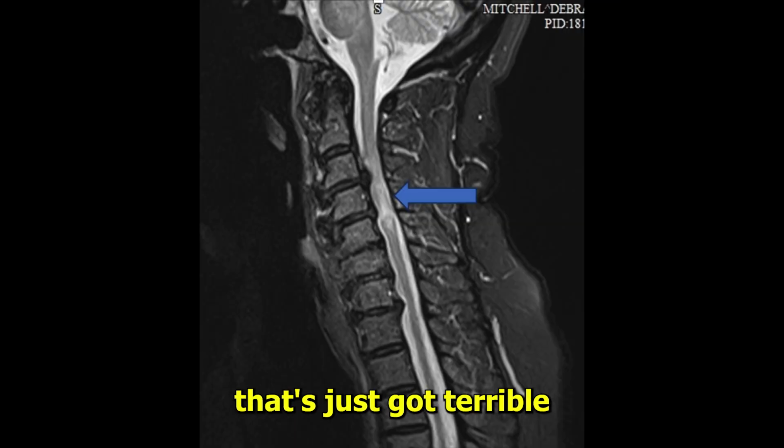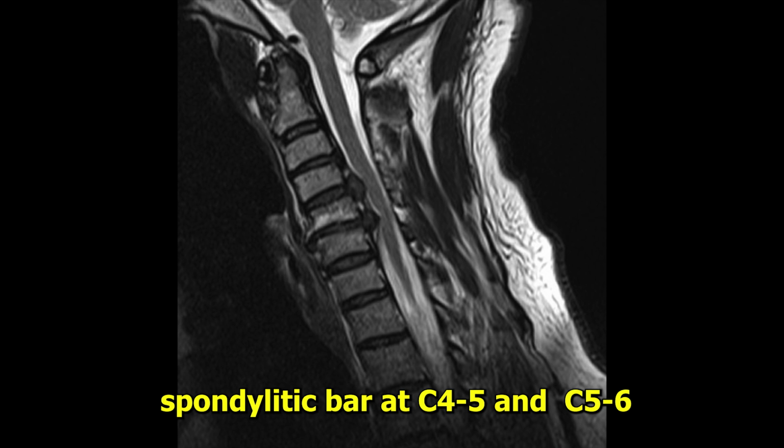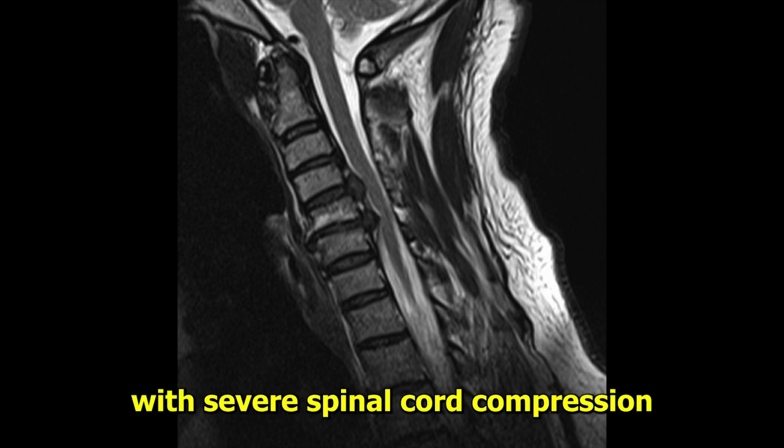Here's another one that's just got terrible disease, the spinal cord contusion. See that blue area? It's pointing at the spinal cord. And here's another one, a large spondylitic bar at C4-5 and C5-6 with severe spinal cord compression.